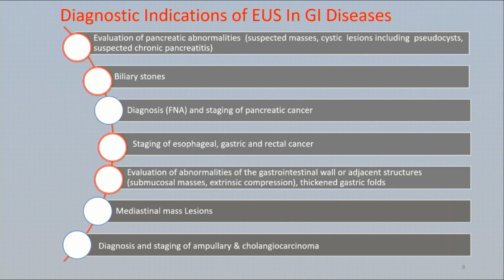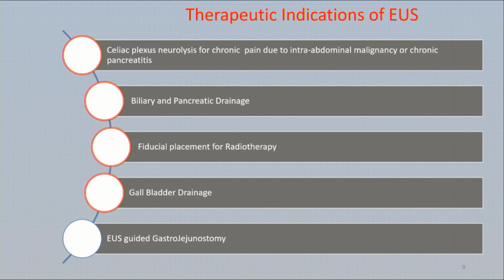So that's the advantage you have with this technique. You can see the mediastinum, you can see the various biliary organs. Then the therapeutic indications of EUS, which is coming in a big way since the last decade.